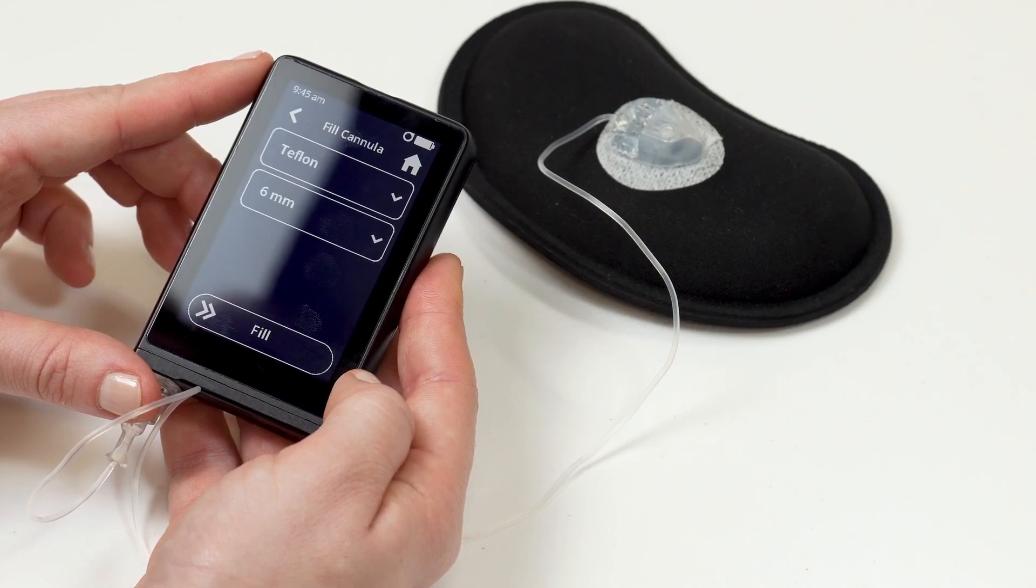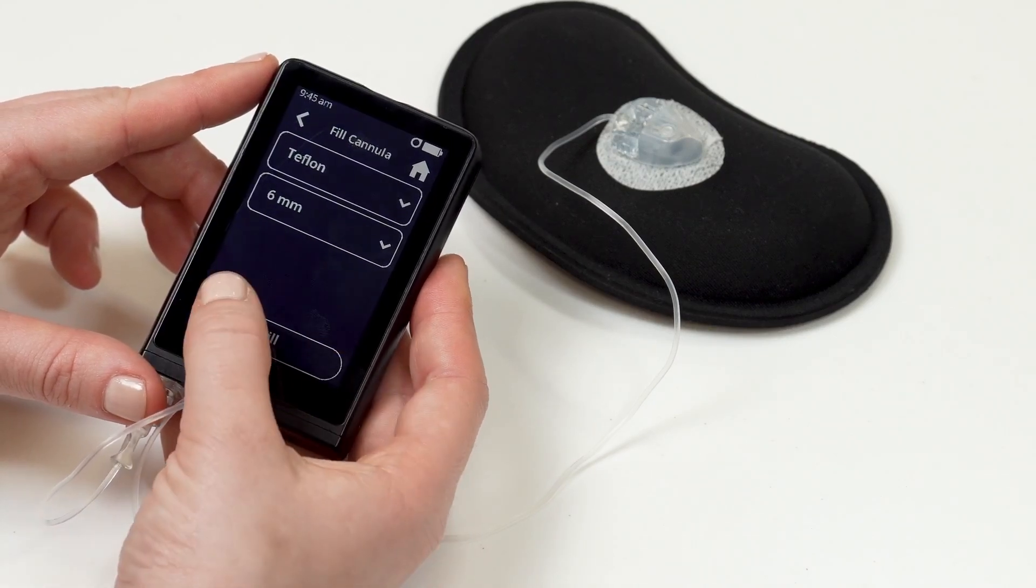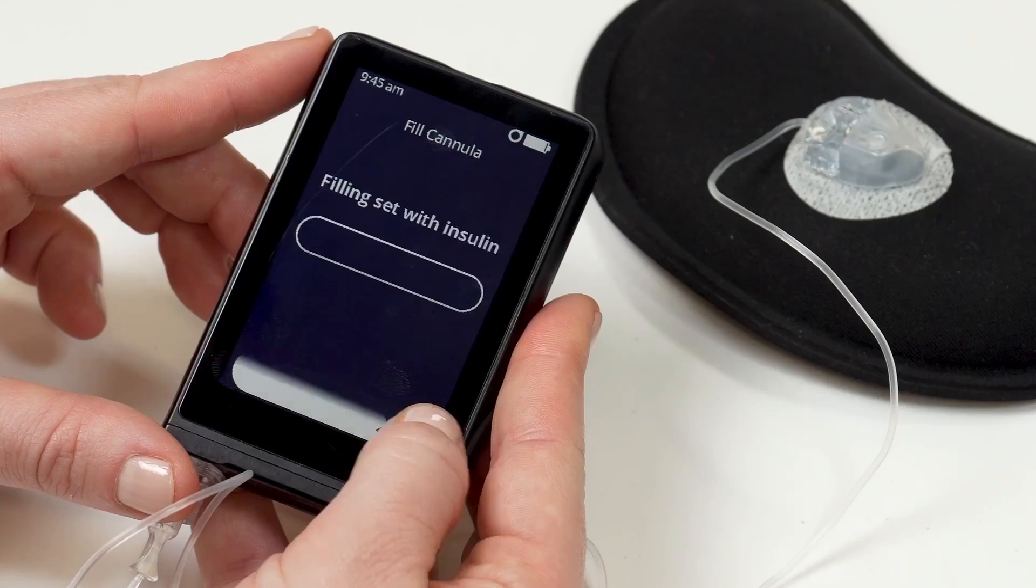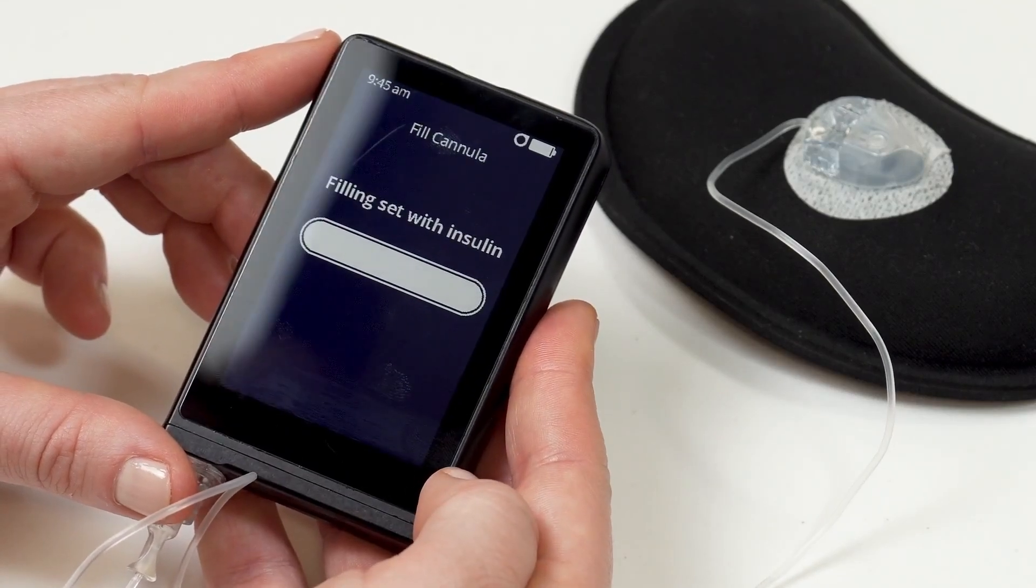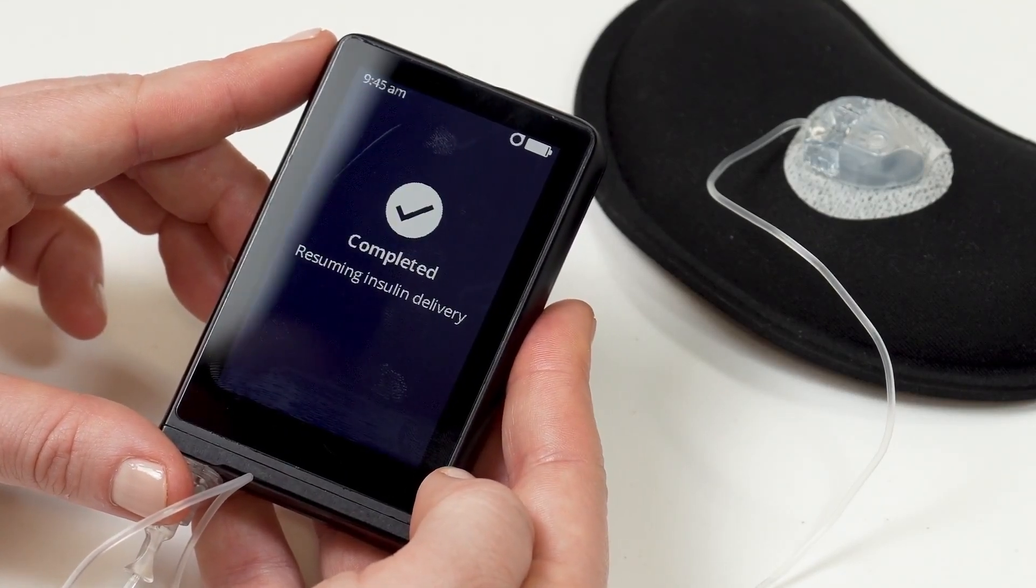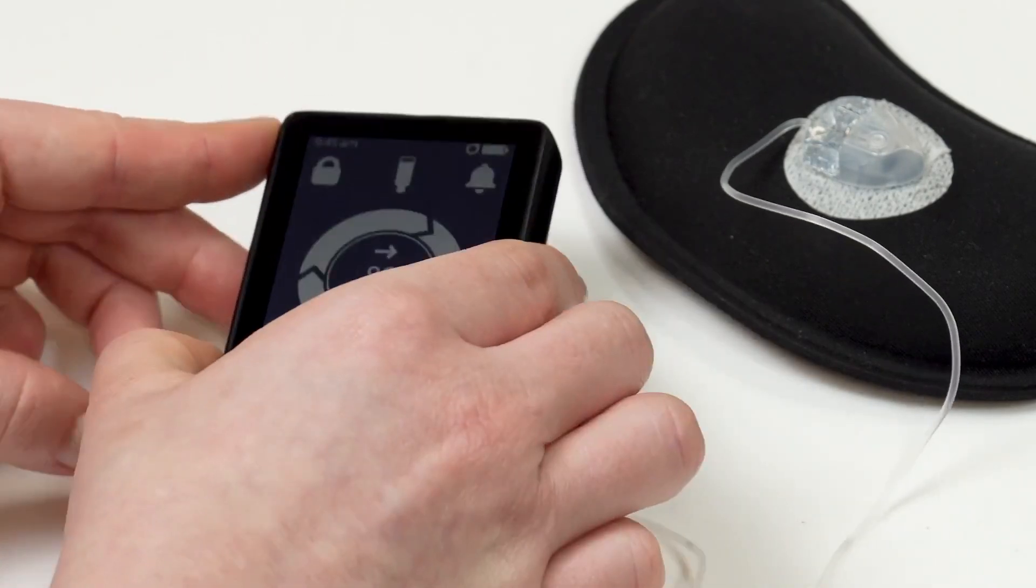The inset uses a teflon cannula. Confirm the teflon cannula and 6mm cannula length are listed. Swipe the fill slider to the right to fill your cannula with insulin.